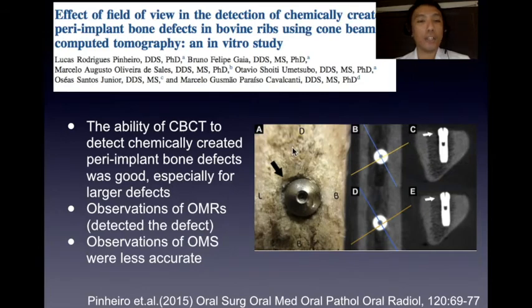That's why if we look at learning CT scans, it has also moved a lot further than before. Papers such as this exemplify why we need to study CT scans or CBCTs, particularly in our profession, because CT scans by themselves are able to detect very clear defects.